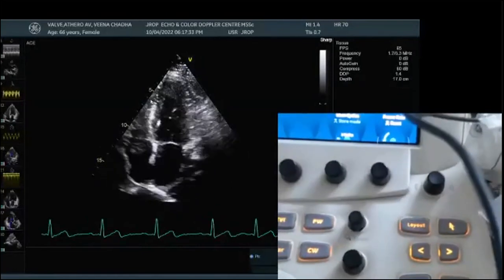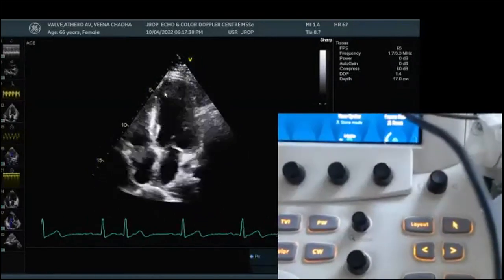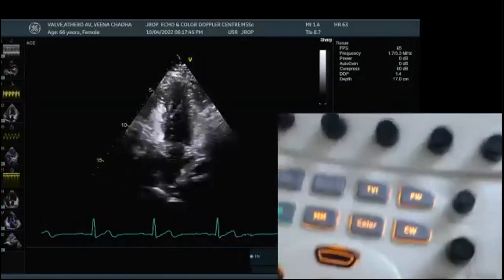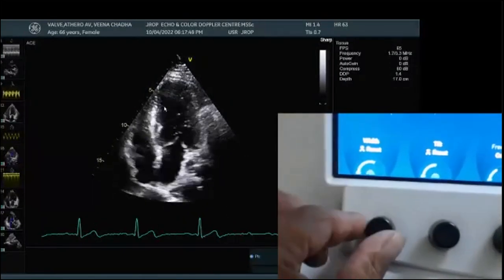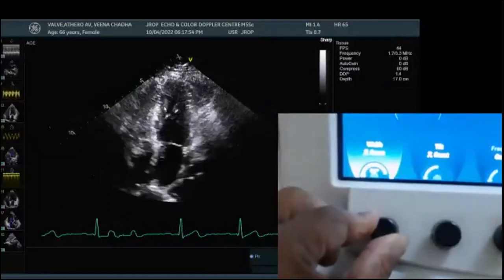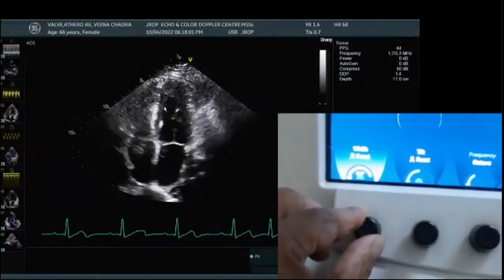And the second question you could ask: what is the Doppler sector which you should use? We should use the Doppler sector when it is able to contain the LV cavity, right? So if I go to the machine again, look, width reset. I'm resetting the width. Can you see that? Yes, sir. This width reset, look at the frame rate on the right side.